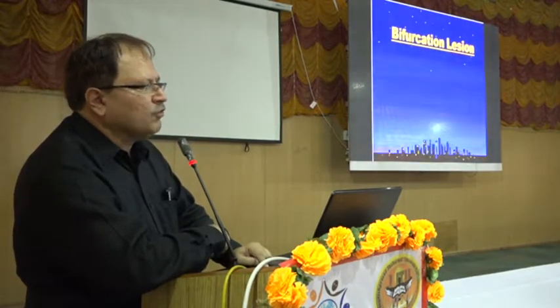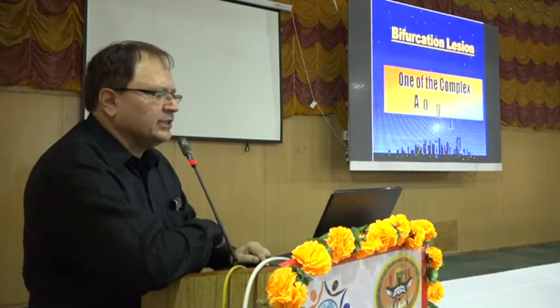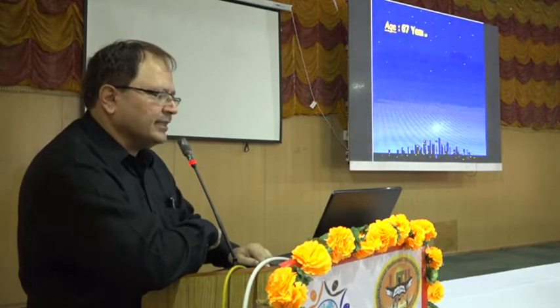Similarly, the bifurcation: what are the new advances in bifurcation lesions? Basically, now we've got good techniques, that is the TAP technique or the culotte technique, to do the bifurcation lesions. And we have got dedicated bifurcation stents also. So I'm skipping this slide.